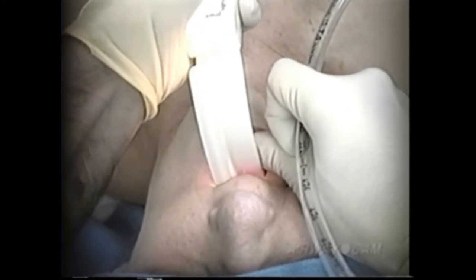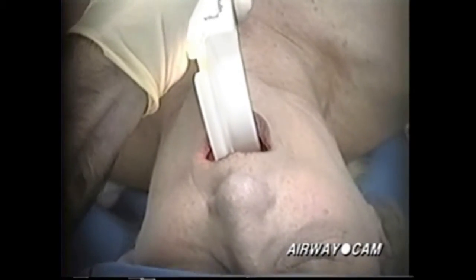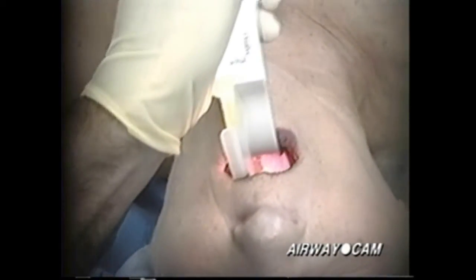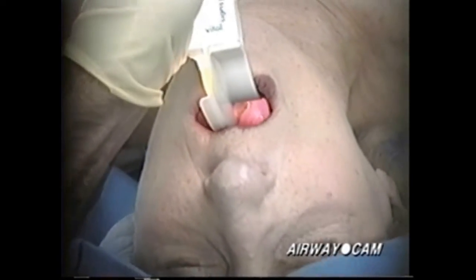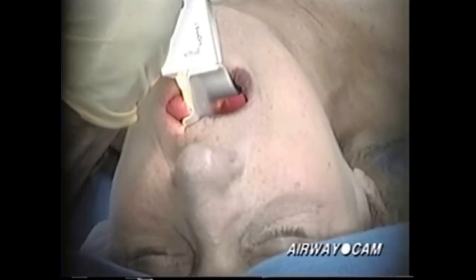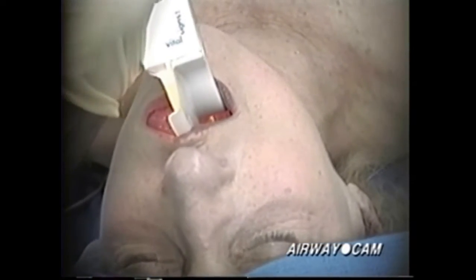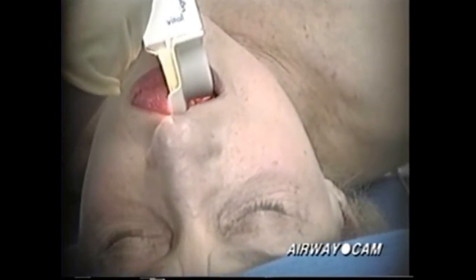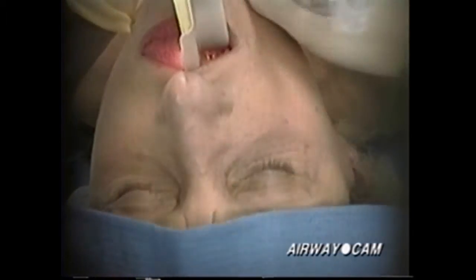The third step in orotracheal intubation is control of the tongue, using the flange of the laryngoscope blade. The larger flange of the curved or Macintosh blade is easier for directing the tongue to the left side of the mouth than the smaller flange of the straight or Miller blade. Also, the curved blade has a natural fit with the curvature of the tongue, and a natural stopping point in the vallecula at the base of the tongue and epiglottis.